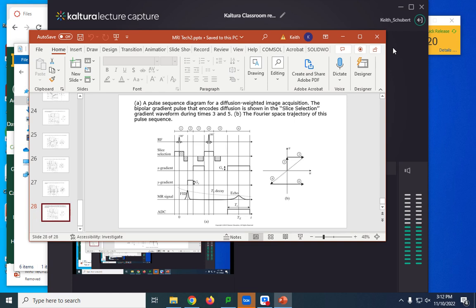So we don't have a lot of choice. Since we're going to read it out over a couple seconds, we hope that it averages. There are areas of your body where it averages better versus worse. So one thing you can do is take multiple measurements for the same area and average them, and that will average out some of the motion that's in there.